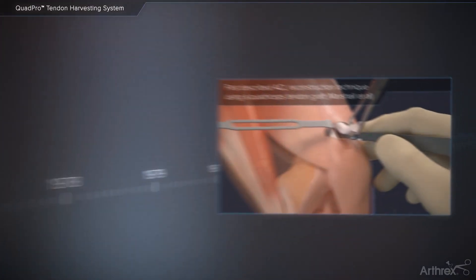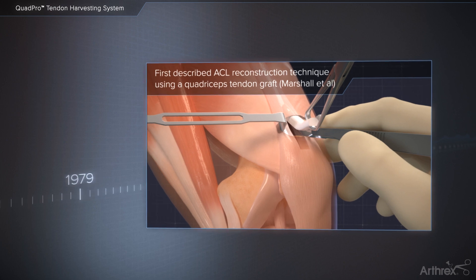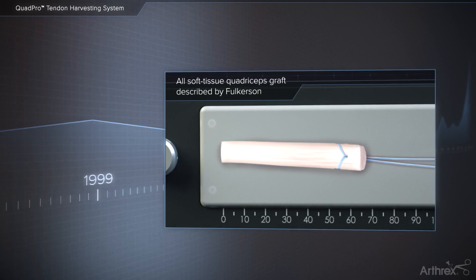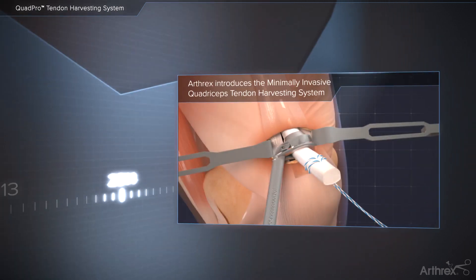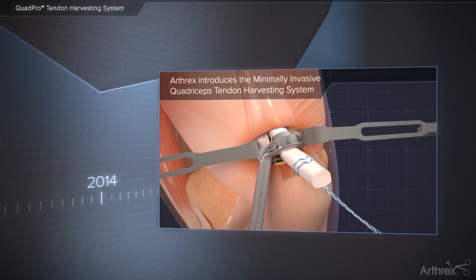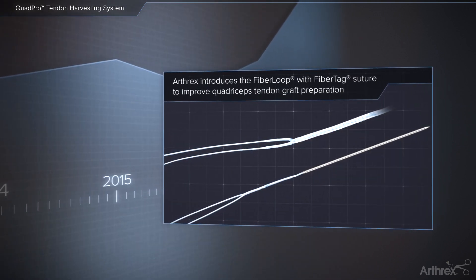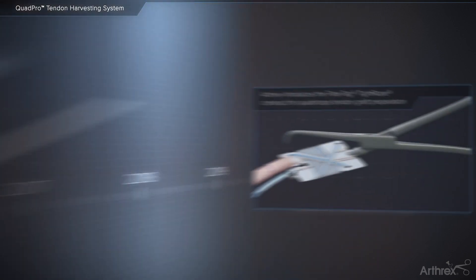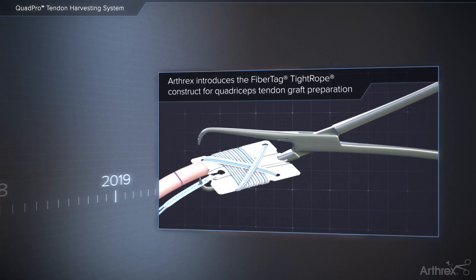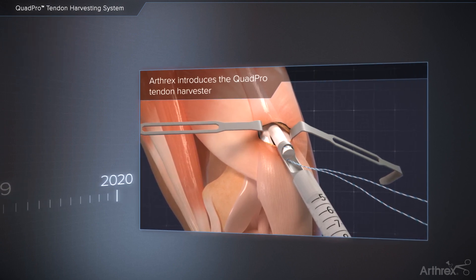The quadriceps tendon was first described as an acceptable graft option for ACL reconstruction in 1979. Arthrax introduced a minimally invasive instrumentation set in 2014, enabling a safe, easy, and more reproducible quadriceps tendon harvest. Between 2015 and 2019, Arthrax released the Fiberloop with FibreTag and FibreTag tightrope implants to further improve performance and efficiency. The QuadPro Tendon Harvester is the next evolution in this ACL reconstruction portfolio.